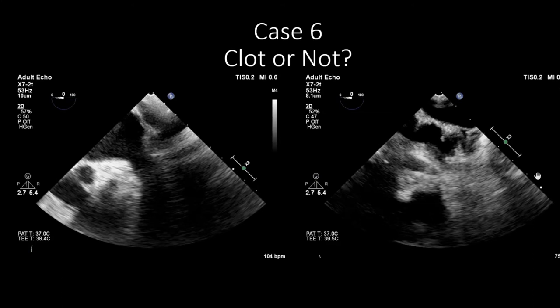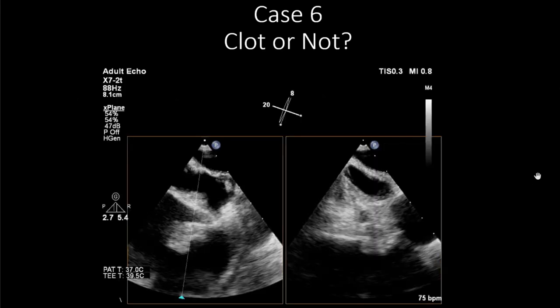This is real-life imaging. You see a nice long shadow making it tough to see the appendage. We switch to another view and see something flickering over here — it's near the opening. Is it real? We thought we saw something there, so we biplane to confirm. It gives you another plane; sometimes we rotate into that plane to see it. There's a little mobile density — independently mobile, moving separately from everything else. It's not in a traditional place, but we called that as thrombus.